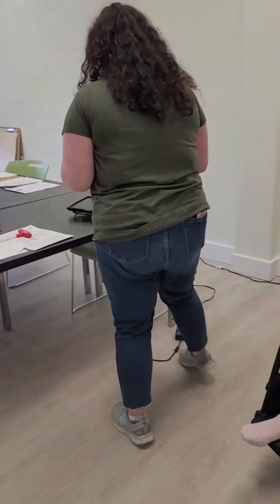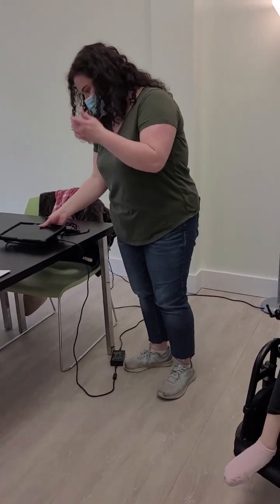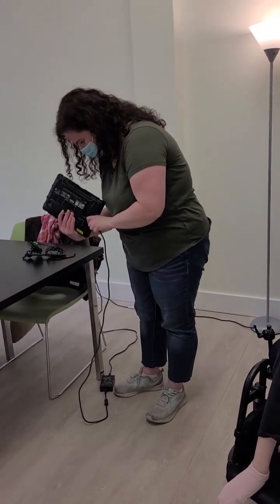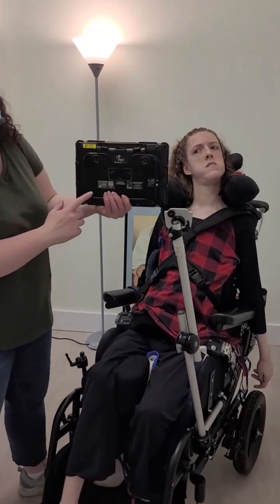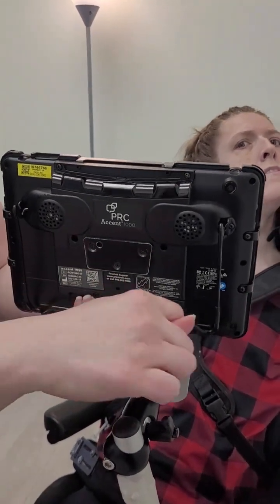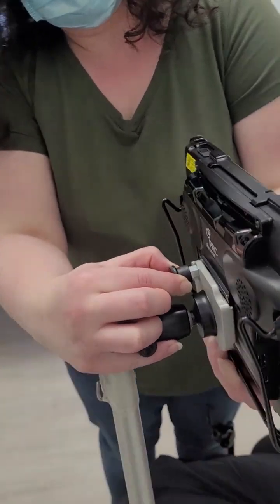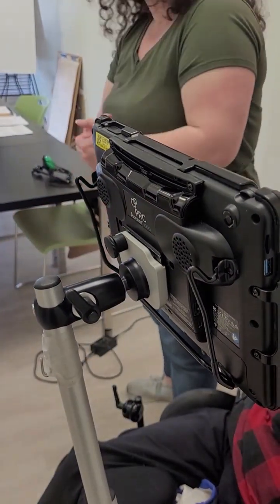Then go to the second drawer of Julie's side table and the device will be in there. Her charger cord hangs out of the handle portion, so you unplug it and usually just toss it on the ground. For sliding this onto the pole, there's this portion right here that slides into this metal piece — pull out this button, slide it down, and let it go. Double-check that it's in there, as the button doesn't always lock.